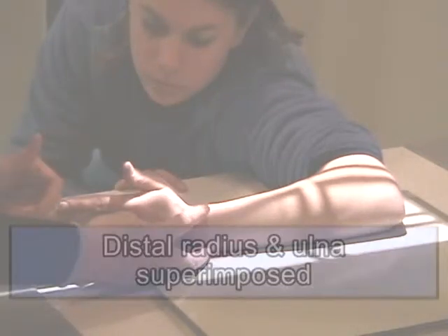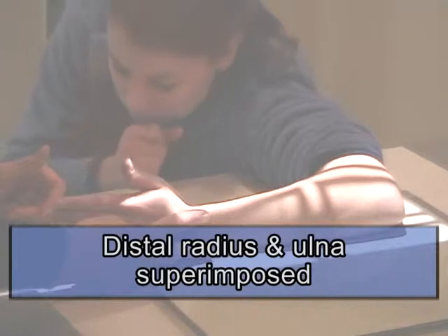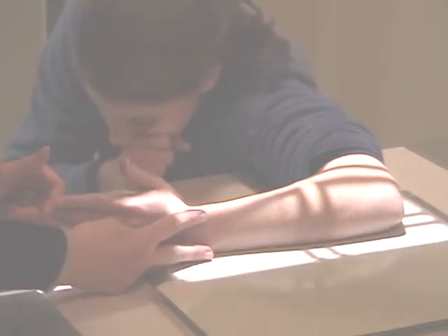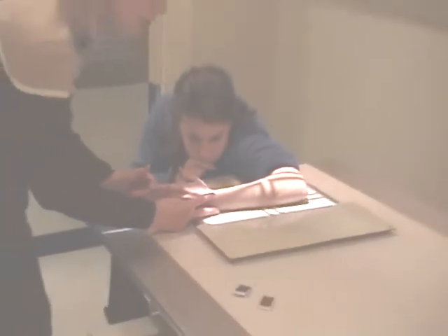I want the distal radius and ulna superimposed. Distal radius and ulna will be superimposed. That's also the criteria when I look at an image on an x-ray. That will determine if I did a good job positioning her lateral. Distal radius and ulna superimposed.